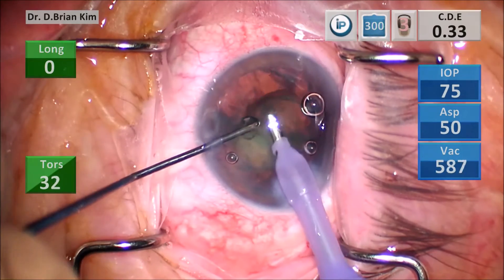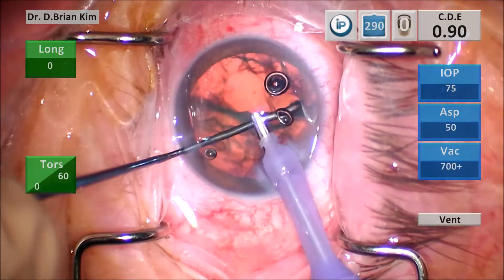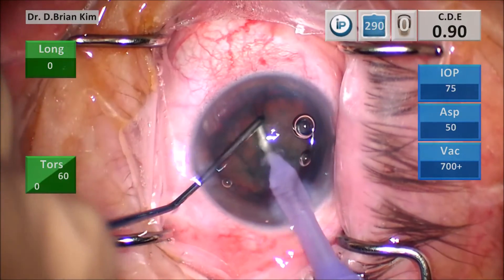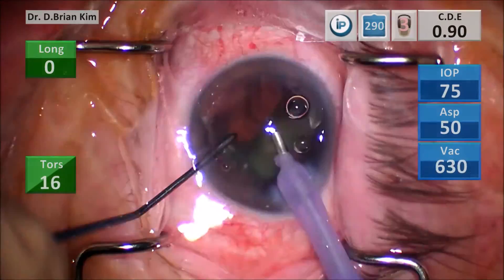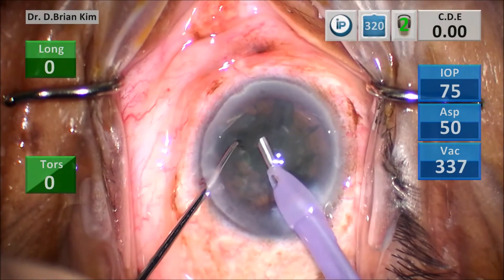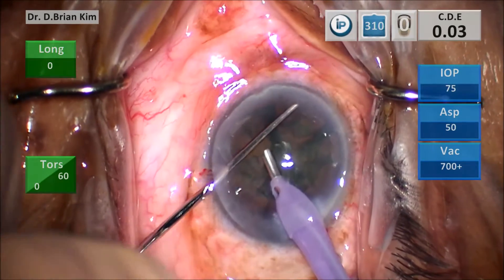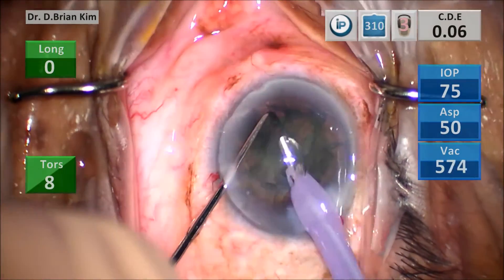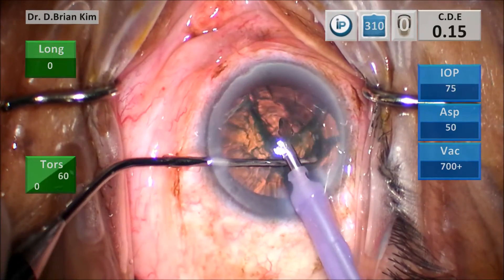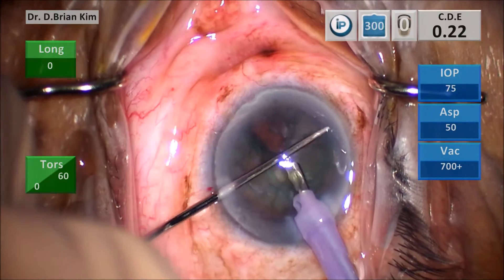Another example: taking the chopper around the equator, around the lens, and pulling it centrally. I also use the chopper to just rotate pieces in front of me. Here, after a cross chop, I'm again having difficulty freeing this lens. Rather than pushing more phaco and aspiration — which is the tendency and the danger — I use the chopper to go around the equator and pull the fragment centrally.